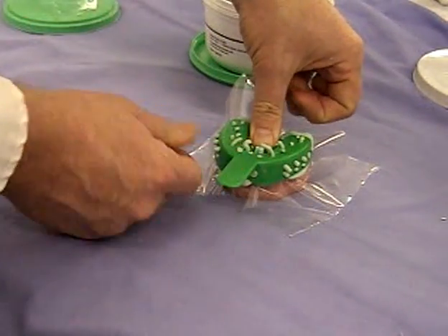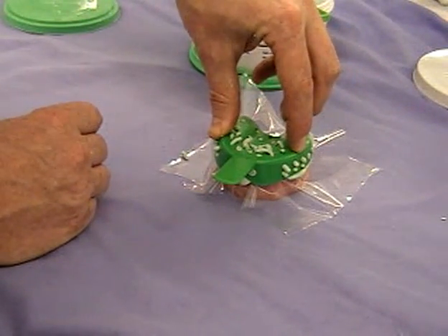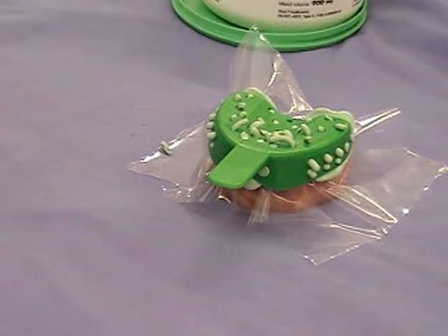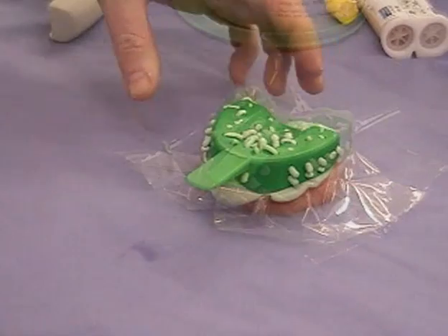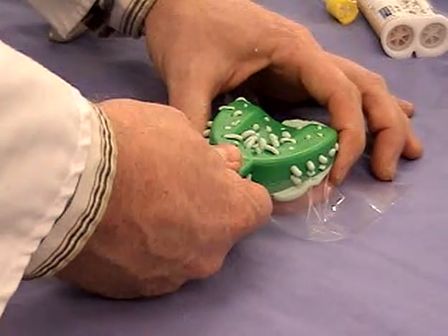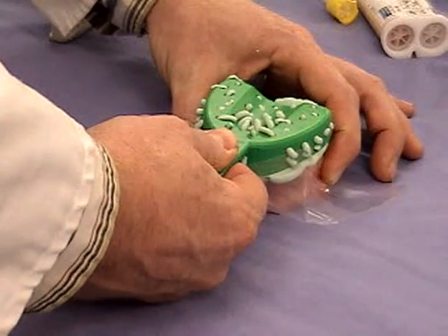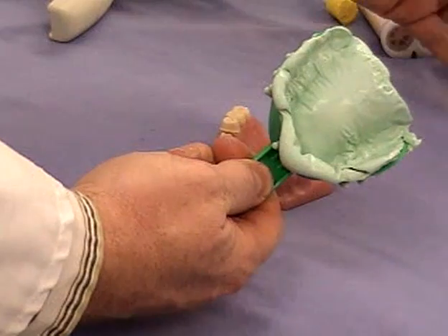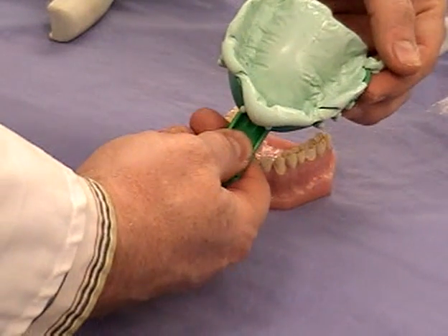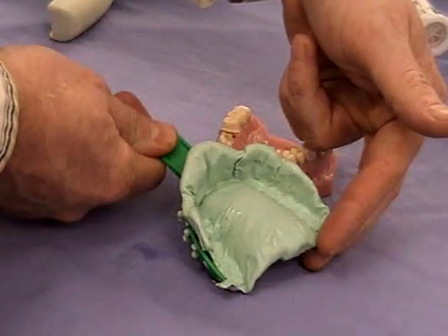You can see there's quite a bit of force being used there. You can see the material coming through the holes on the tray — that's going to act as retention, so we're not using any tray adhesive in this case. That was about three minutes gone there at least, and you want to use a fingernail test: if you can make a dent in it with your fingernail, it's not ready. In this particular case it wasn't quite ready, so we had to leave it a little longer.